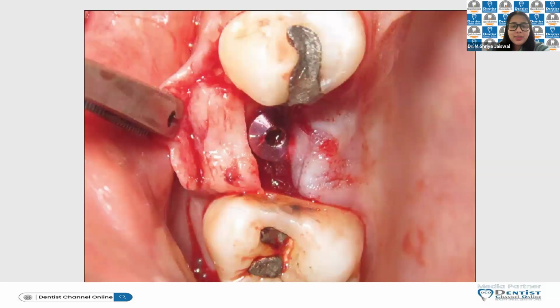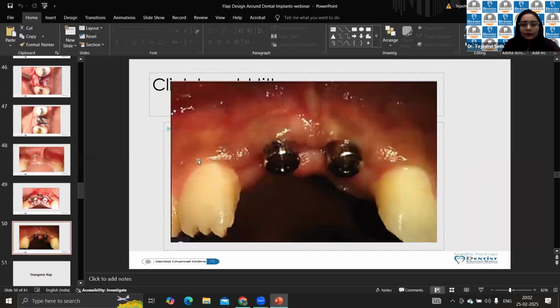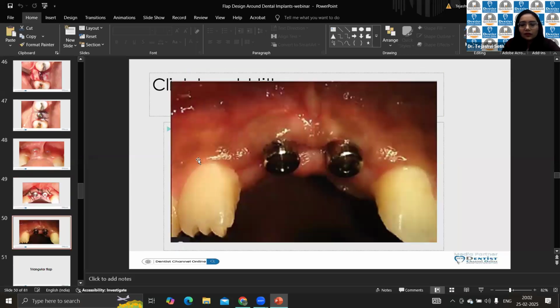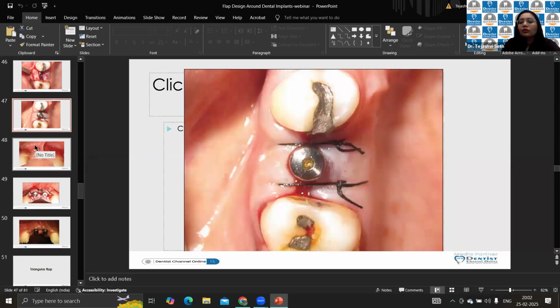Okay. So the next one is from Shruti Joymon. What are the chances of black triangle formation in the palatal roll technique? See, if we are doing the palatal roll technique, if I just show you that slide. See, while you're doing a palatal roll technique, all you have to think of is just whether you want to give the patient temporaries or not.